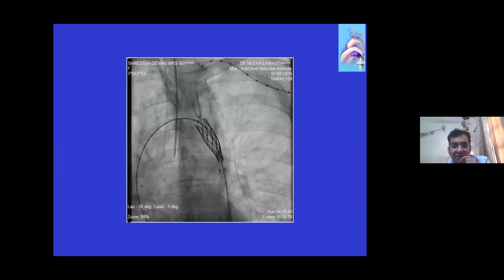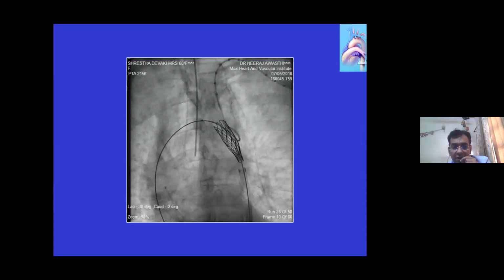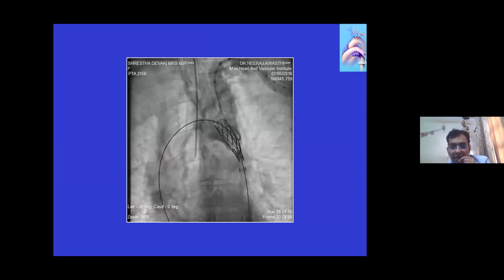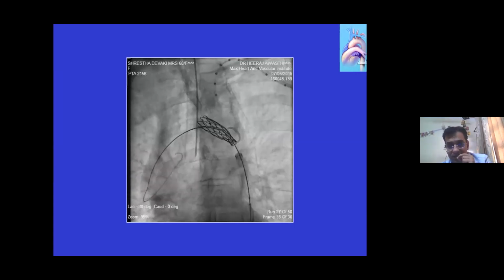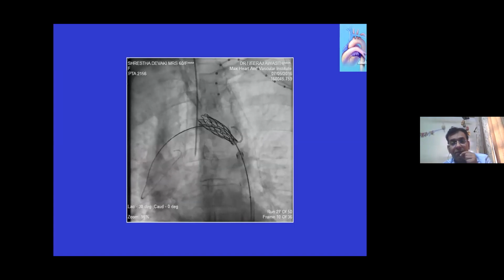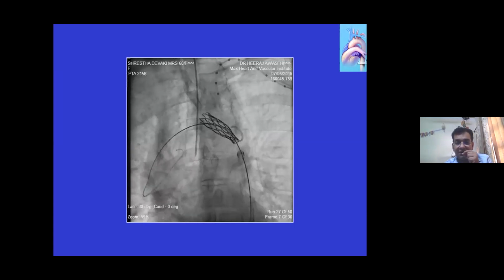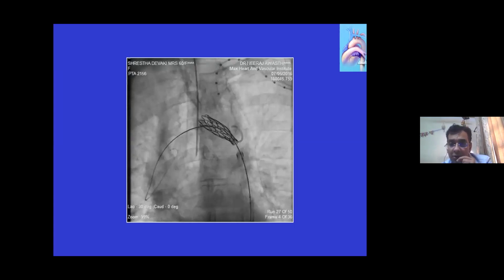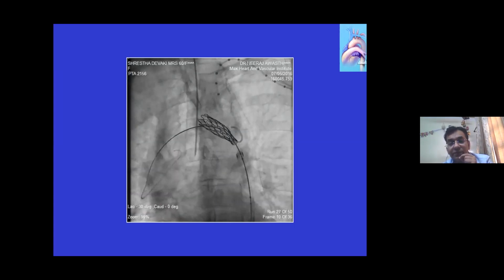But as the attempt is being done, it is being tried to pull into the segment. There you see it, the stent has migrated. What has happened is, as the 10 millimeter stent was being pulled proximally by the inflated inner balloon, the partially inflated inner balloon just pulled through the proximal segment, and there is no balloon over it. The stent is just over the wire now. It is lying in the proximal segment, but luckily it is over the wire.